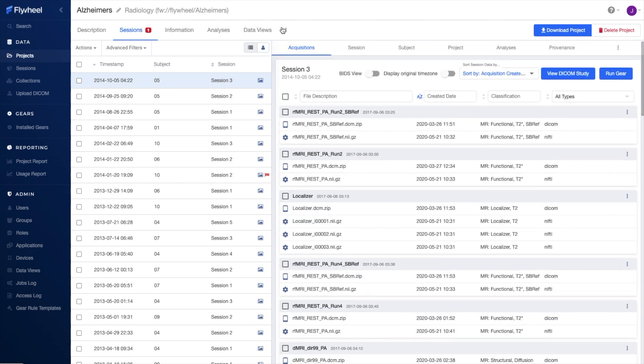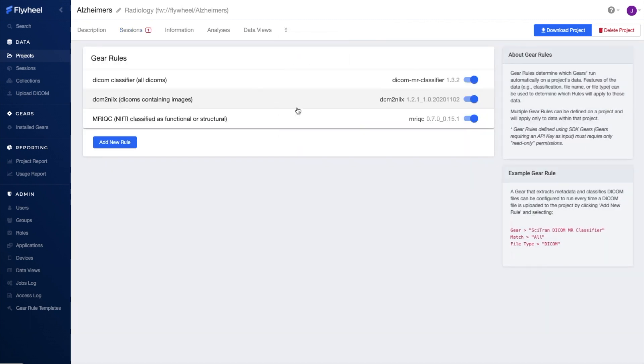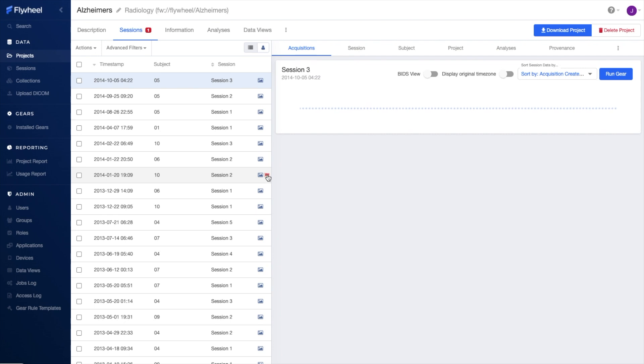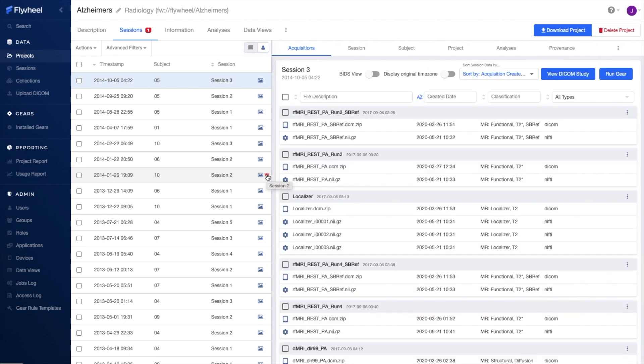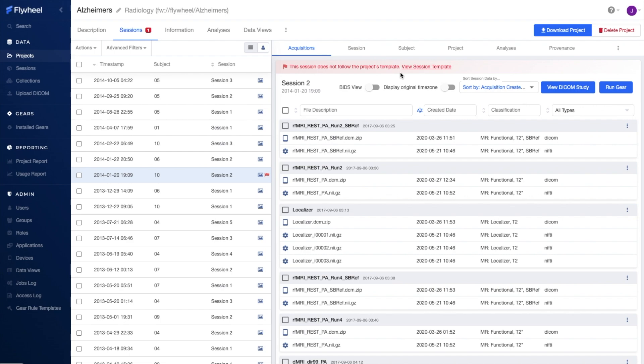With our rules framework, we can automate preprocessing and quality control on your incoming data. We also have a template feature that allows you to define the expected structure of your project data and will alert you in the event of a mismatch. In tandem, this helps ensure that your data is complete and of the expected quality.